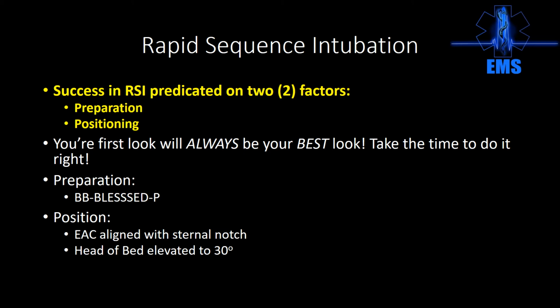So when you stick the blade into the throat and you are rewarded with a beautiful grade 1 view of the epiglottis and the cords, and you can pass that tube first shot, it builds your confidence. When you get lost in there and all you see is soft palate or tongue, even if you have been doing this for a long time, there's an element of panic that creeps up. And now you have to talk yourself down from that. So if you position the patient correctly and you prepare yourself and you anticipate some of the landmines that are coming, you'll be much better able to intubate these folks.